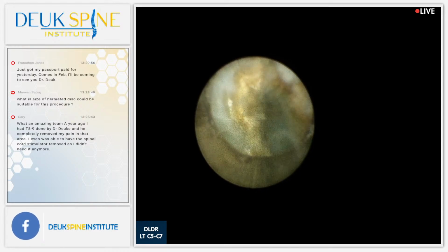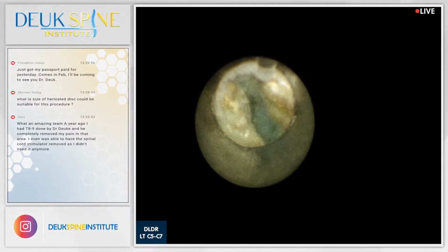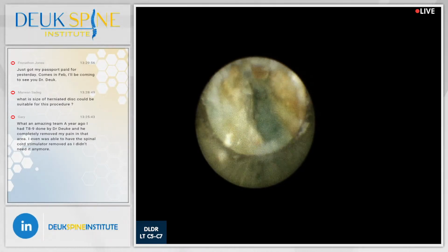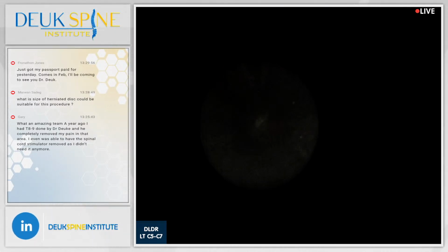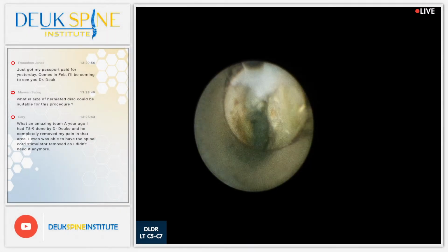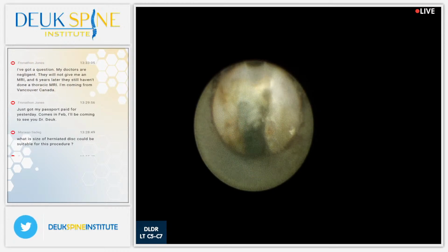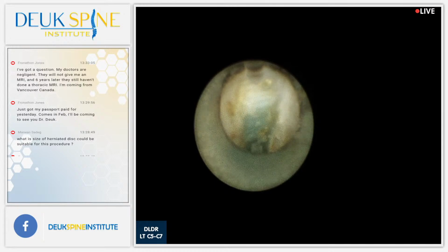So the beauty of what we're doing is that you see all the stuff that I've lasered away, that's all herniation. None of it is normal. None. So by doing this surgery, we're not taking any good normal bone or ligaments out. We're just taking the herniation out. This is such a nice surgery because it preserves the normal structures of your spine. It doesn't remove normal stuff like other surgeons do. And the only reason we can do this is because we're doing it arthroscopically.